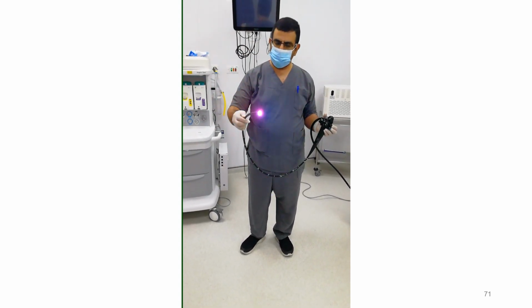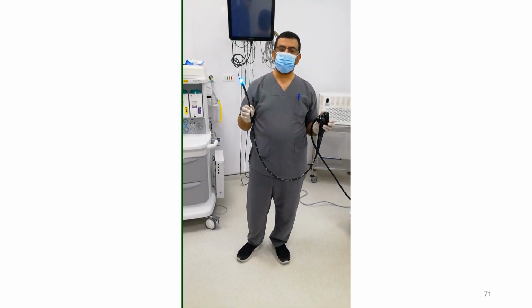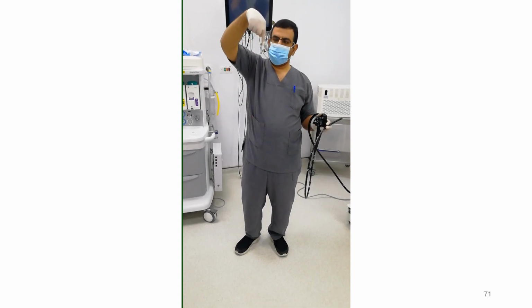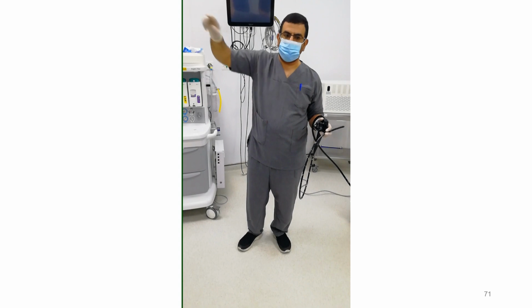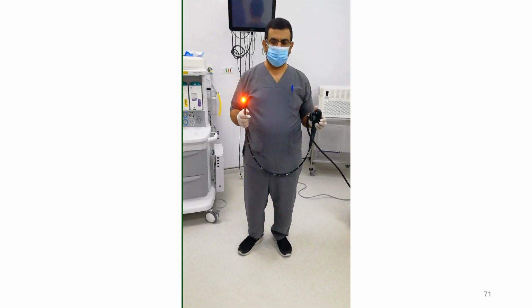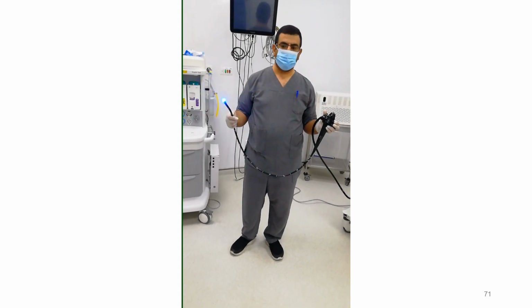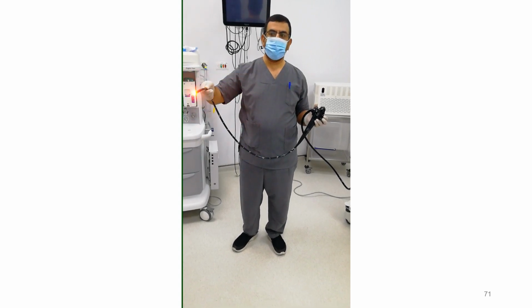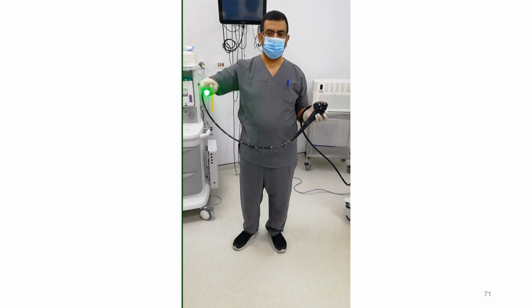فهخليني ماشي ماشي ماشي خلاص، وبدي جير، بدي كونتينوس على الإير طبعا لغاية لما أوصل عند اللور إسوفجيال سفنكتر. اللور إسوفجيال سفنكتر يا جماعة ما بتكونش نازلة كده في المعدة، لا بتكون نازلة بكير زي صباعي. فعشان أخش فيها لازم أعمل حاجة من حاجتين، يا أدي سنة ليفت بالمنظار يا إما نعمل إيه؟ ولا حاجة. مجرد ما توصل عند اللور إسوفجيال سفنكتر هعمل تورك شمال. تورك شمال إزاي؟ أنتي كلوك وايز موفمنت.